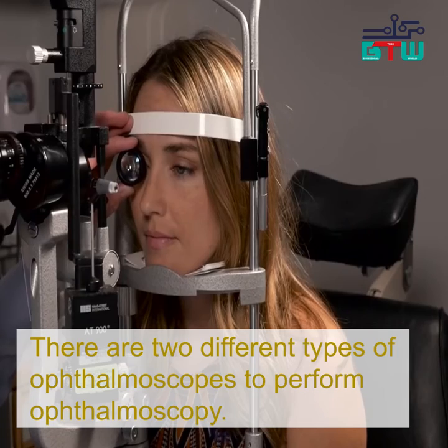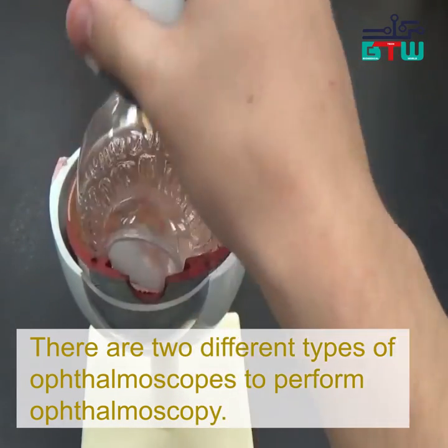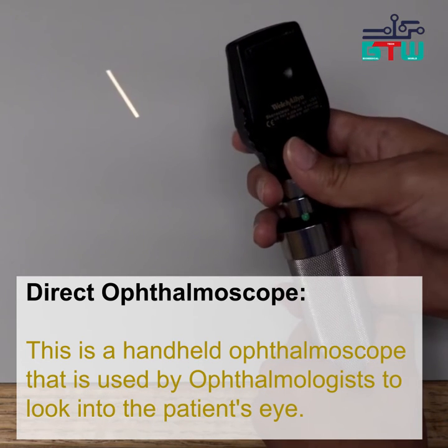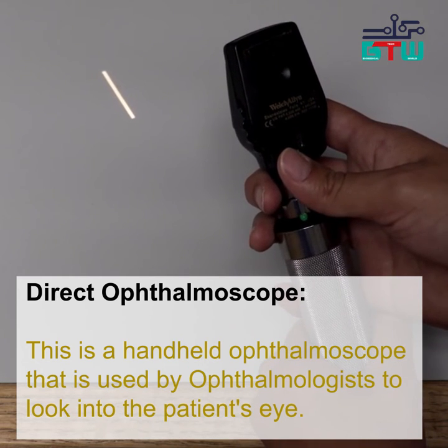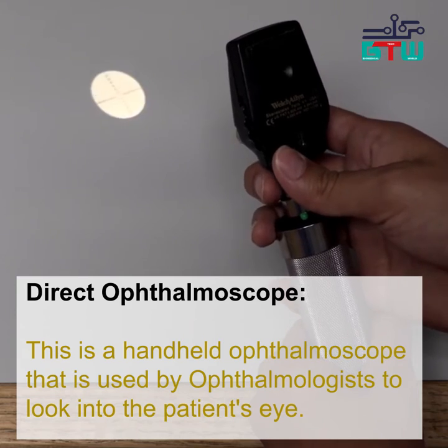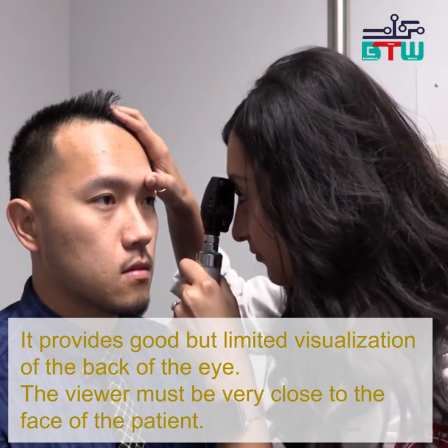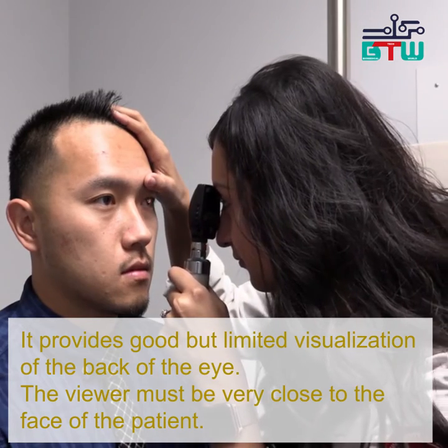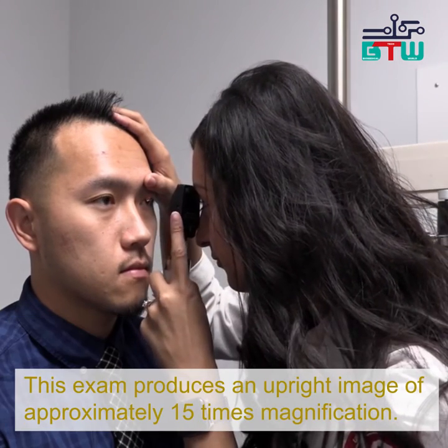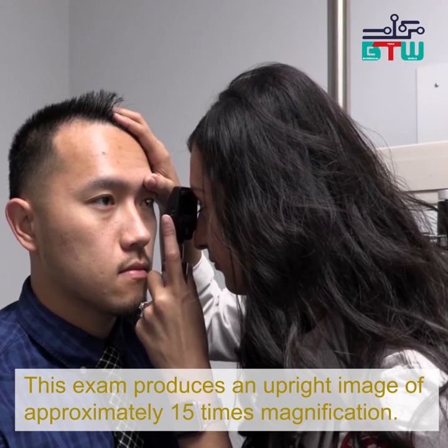There are two different types of ophthalmoscopes to perform ophthalmoscopy. Number one is the direct ophthalmoscope. This is a handheld ophthalmoscope that is used by ophthalmologists to look into the patient's eye. It provides good but limited visualization of the back of the eye. The viewer must be very close to the face of the patient. This exam produces an upright image of approximately 15 times magnification.